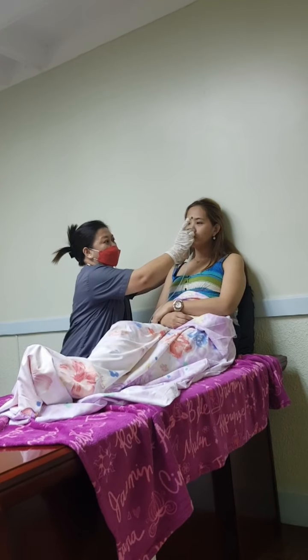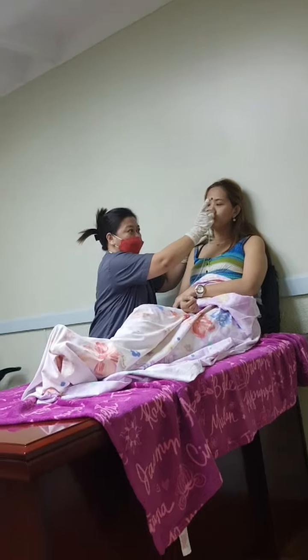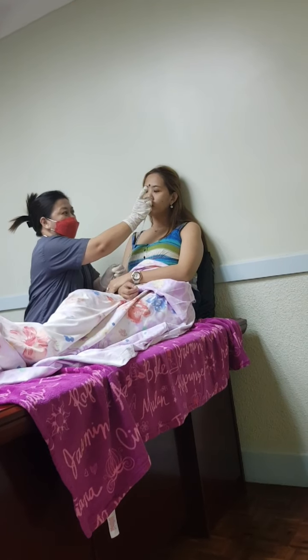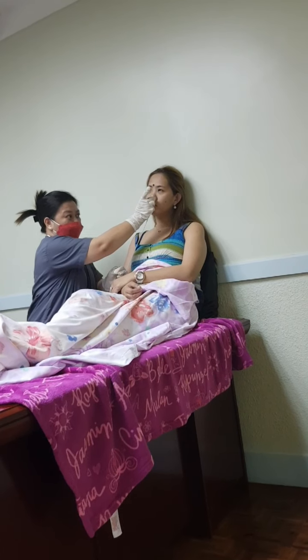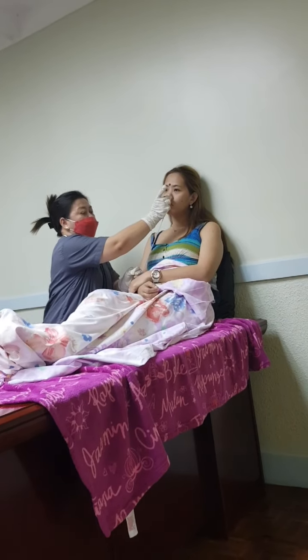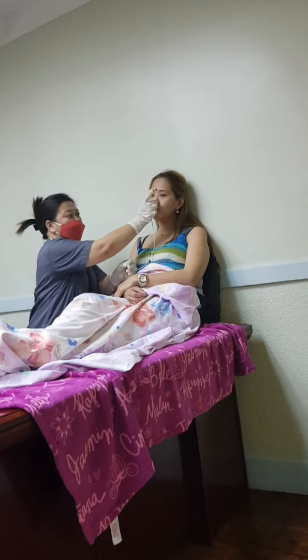Advance the tube in a downward and backward direction when the client swallows. Stop when the client breathes. If gagging and coughing persist, check the placement of the tube with a tongue depressor and flashlight if necessary. Excessive coughing and gagging may occur if the tube has curved in the back of the throat. Keep advancing the tube until the tape marking is reached.